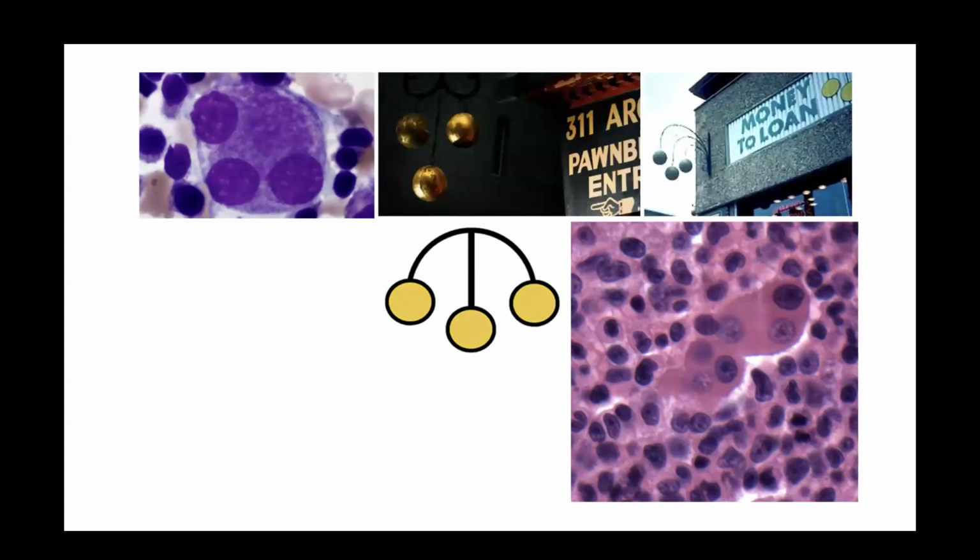This symbol apparently has its origins in the coat of arms of the Medicis. If you've traveled in Florence, Italy, and you look at the many structures that the Medicis owned and built historically, you will find the symbol with three balls. They were merchants, and so this has been adopted by pawnbrokers over the years. So pawn ball megakaryocytes is a term used to describe this morphology.